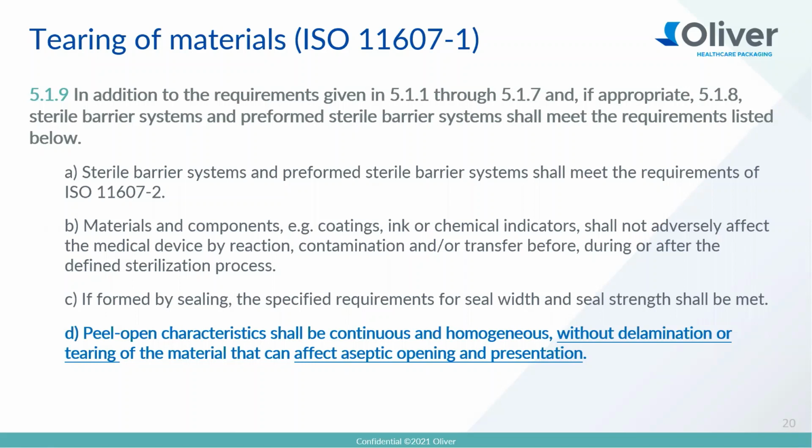When you would open a package and it would encapsulate the product, the nurse has to reach in and try and grab it and pull it out, and they may contaminate it. That also hinders them from dropping it into the sterile field. So that is what this historically meant.